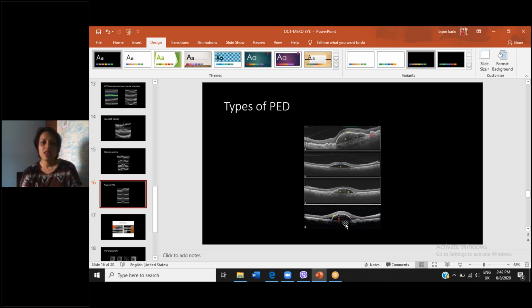So this lady had this choroidal neovascularization related subretinal fluid, which we treated. And on the other eye, if you see here, just underneath the retinal RPE, there's a mound of homogeneous material there. It looks kind of compact. It's not fluid-like. It's not like fibrovascular. It looks like a dense material there.